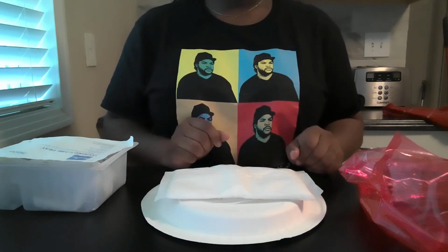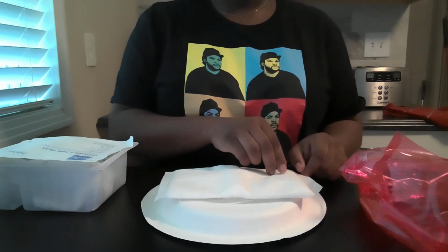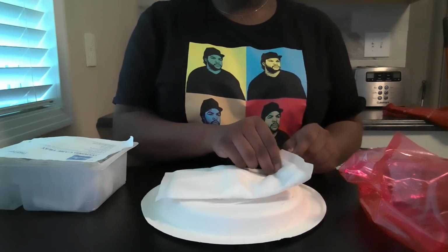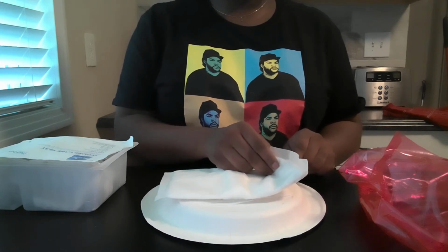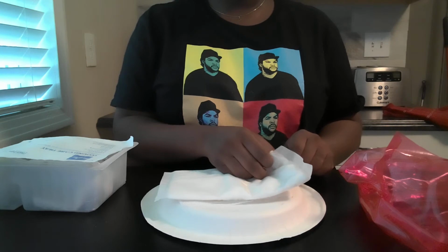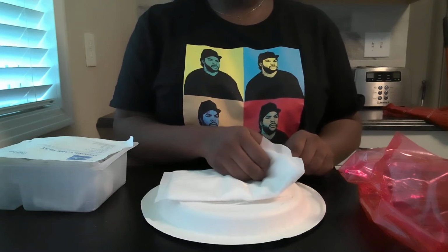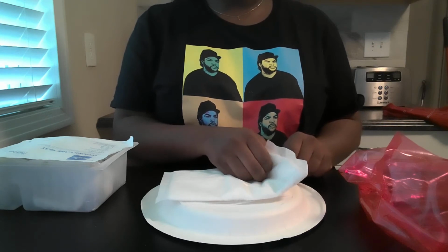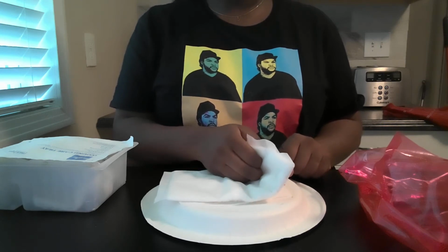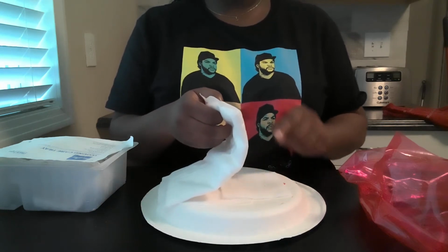Now I'm going to lift this dressing up. When you're lifting the dressing up, you want to pull it off parallel to the skin, and also in the direction of the hair growth. While you're doing that, you want to hold the skin down just to make sure that it's not coming up with that pad.